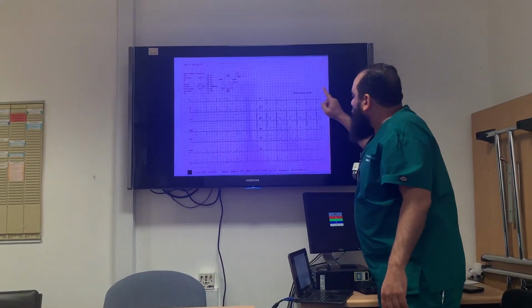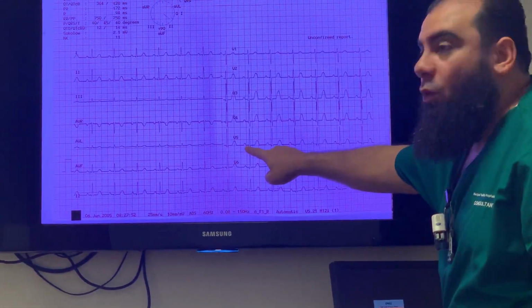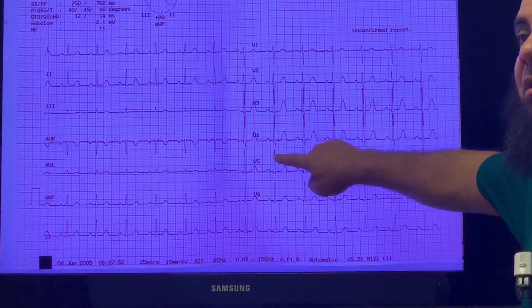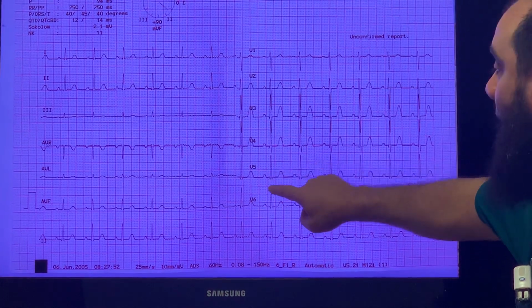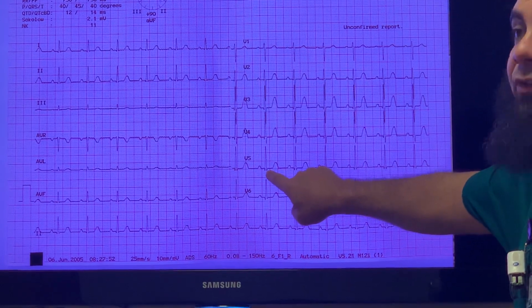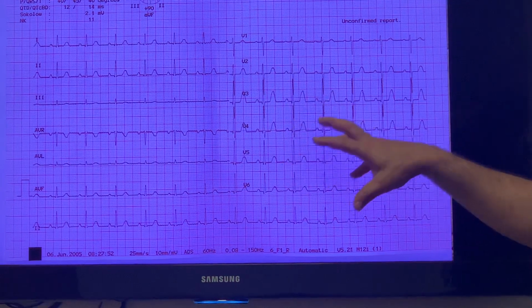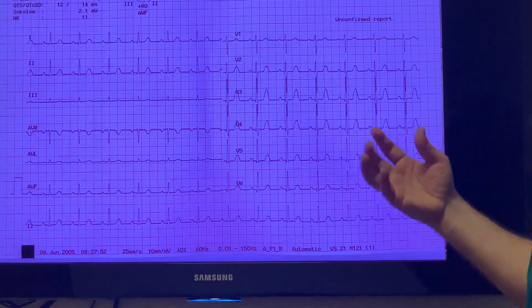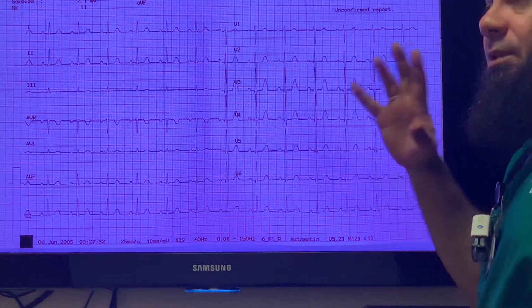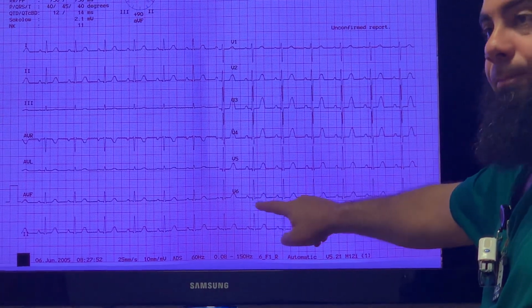Okay. So here in V5 and V6, you can see the QRS. The small q records the excitation of the interventricular septum, the big R is the depolarization of the left ventricle, and the small s represents the right ventricle. So the QRS complex is a bit complicated because it represents two big chambers. The P wave represents two tiny chambers, so no big deal, but here it represents big chambers. Same way in V6.